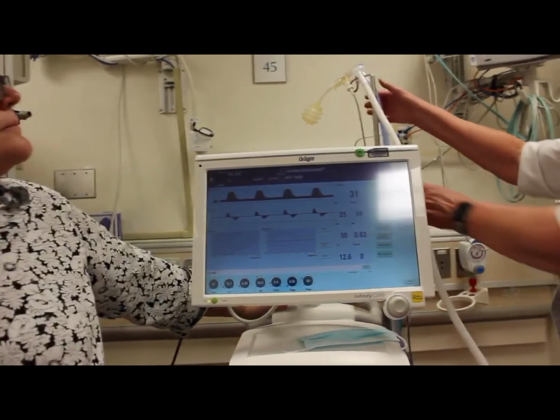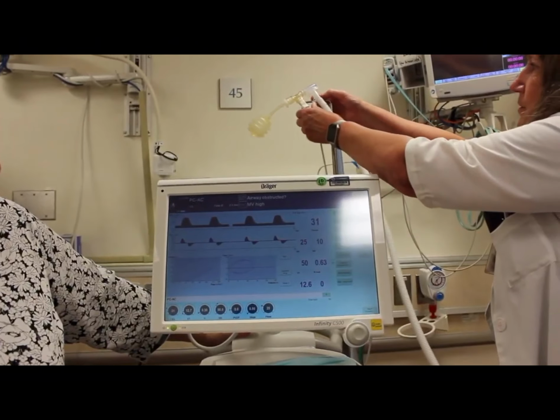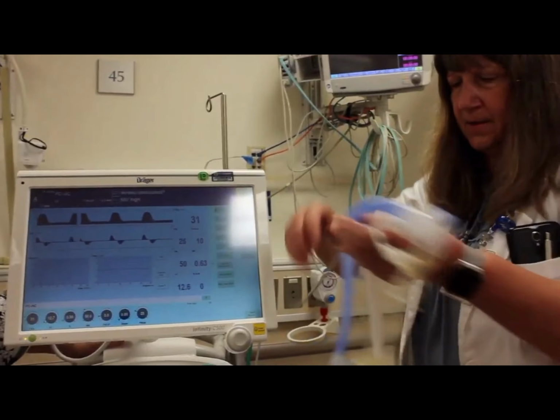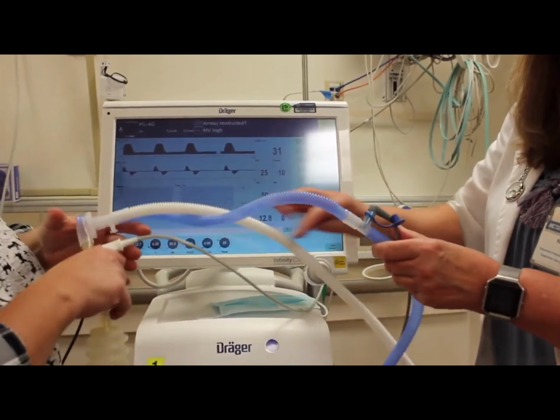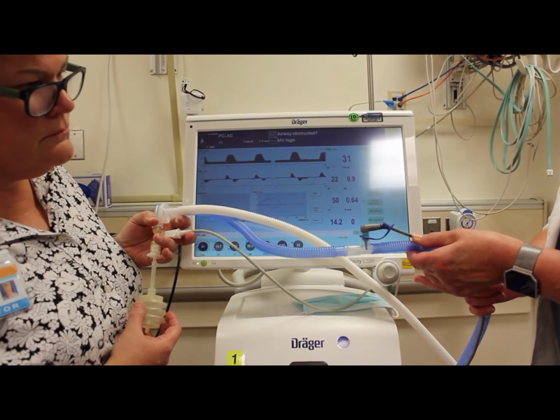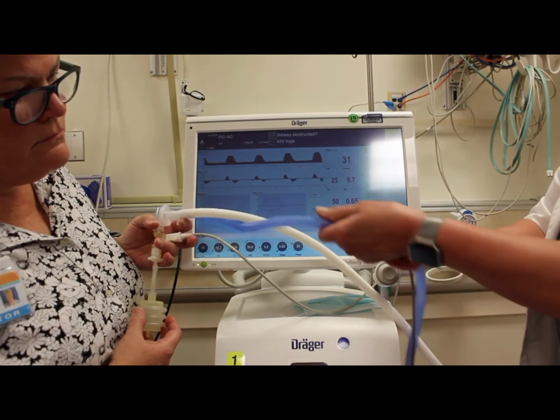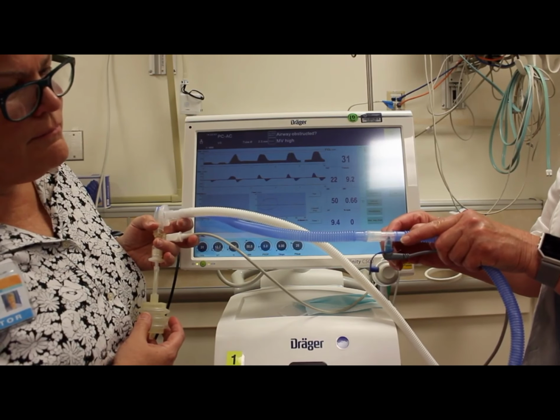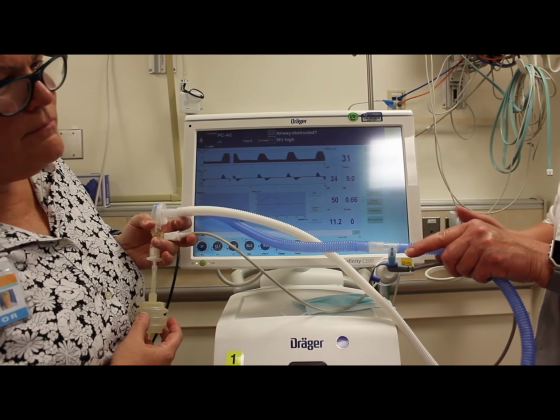Most of the rain out is caused by having your upper temperature probe turned the wrong direction. I'm just going to move this over here. Hold the baby. Thank you. Your temp probe should be pointed like this in your bed. If it ends up turned like this, the water sits on it, it makes it cold. So it's going to keep heating up to try and warm it up.